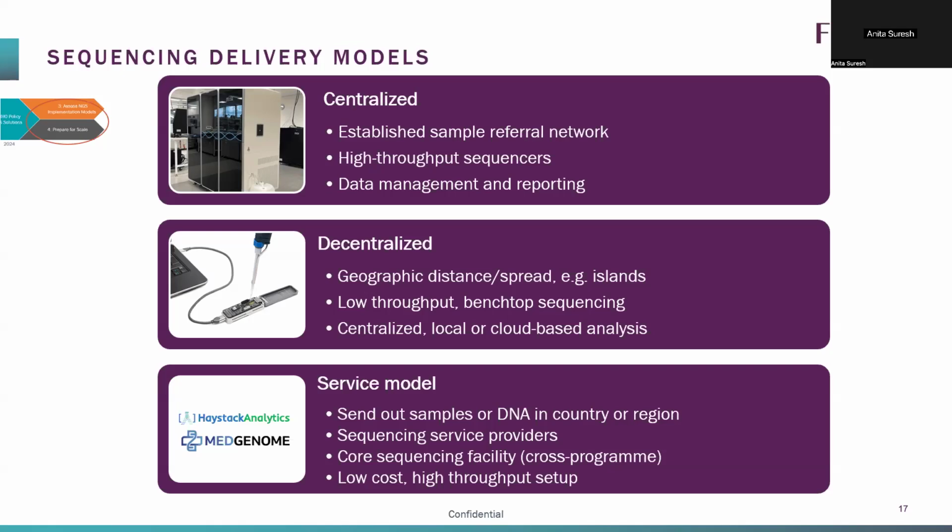These could be core sequencing facilities in large health systems or academic groups, or they could be commercial providers like this, where they can really lower their costs, right? They can optimize their costs. They can put on as many samples as needed in one run. So it saves the individual labs or groups from setting up their own sequencing facility.